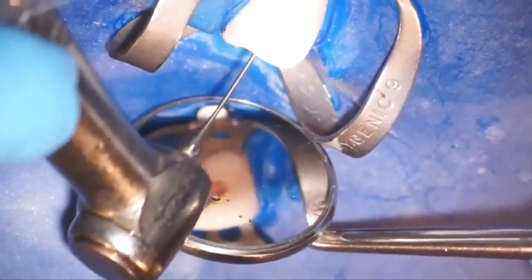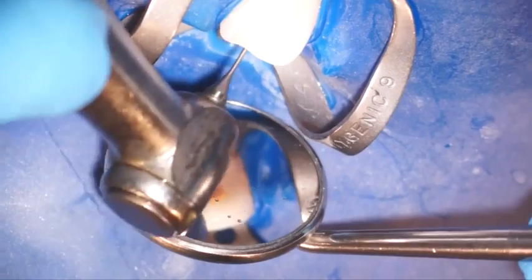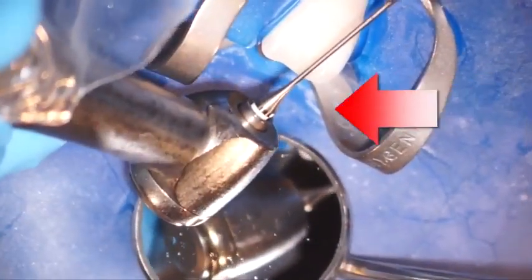So this is a number two Gates. And then we'll move to the number three Gates.